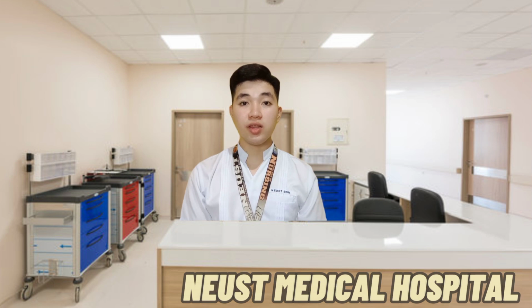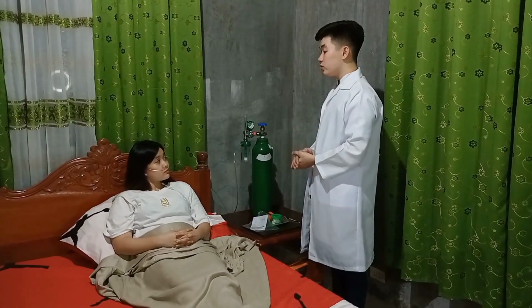Then, encourage patient to breathe through the nose with the mouth closed. Breathing through the nose inhales more oxygen into the trachea, which is less likely to be exhaled through the mouth. So, ma'am, I encourage you to inhale through your nose while closing your mouth.